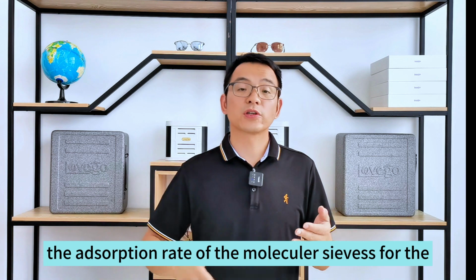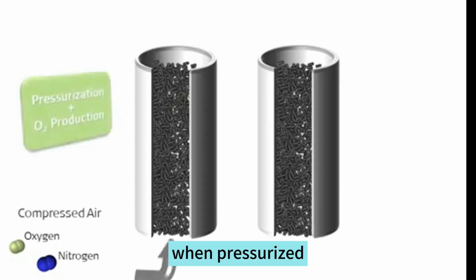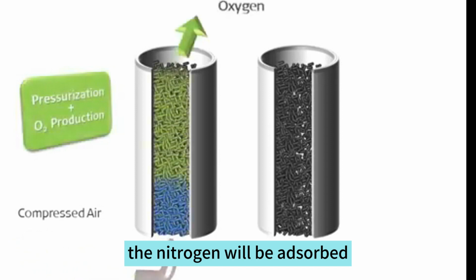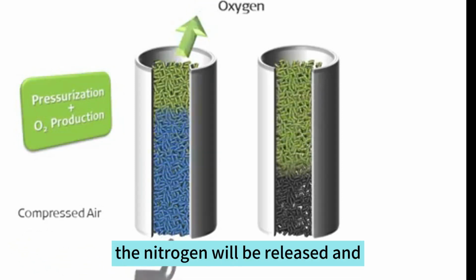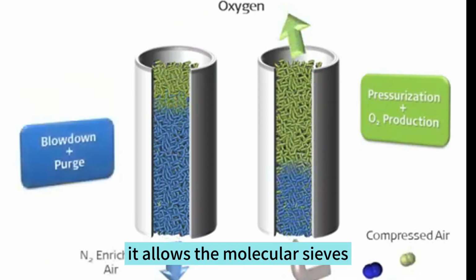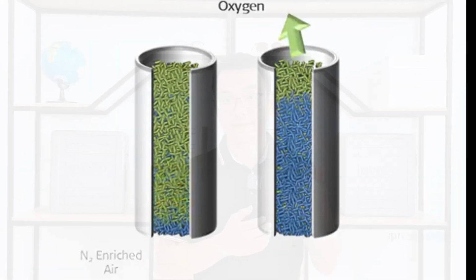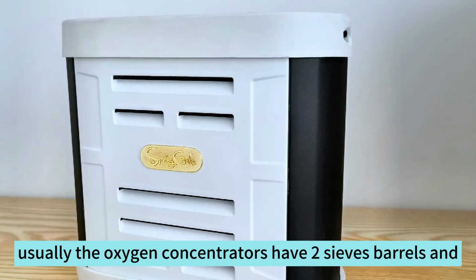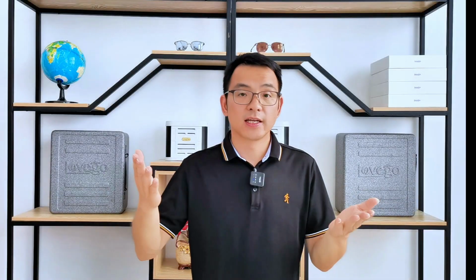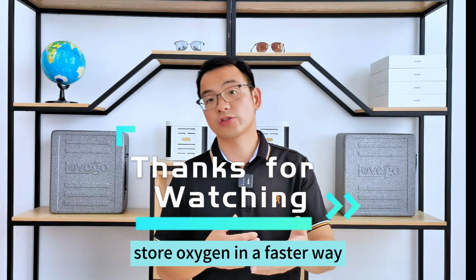The adsorption of the molecular sieves for the nitrogen is related to pressure. When pressurized, the nitrogen will be absorbed, and when depressurized, the nitrogen will be released and discharged into the air. It allows the molecular sieves to regain its capacity to absorb the nitrogen for recycling. Usually, the oxygen concentrators have two sieve barrels, and each will work alternatively to separate the oxygen and store oxygen in a faster way.